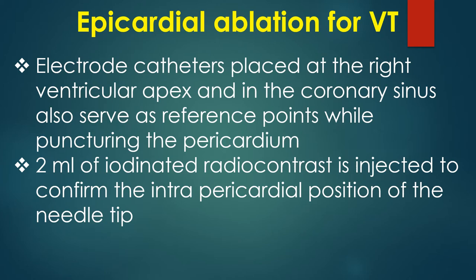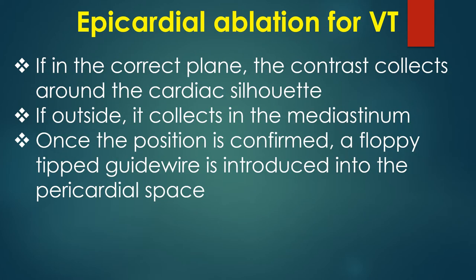Electrode catheters placed at the right ventricular apex and in the coronary sinus serve as reference points while puncturing the pericardium. 2 ml of iodinated contrast is injected to confirm the intrapericardial position of the needle tip. If in the correct plane, the contrast collects around the cardiac silhouette. If outside, it collects in the mediastinum.